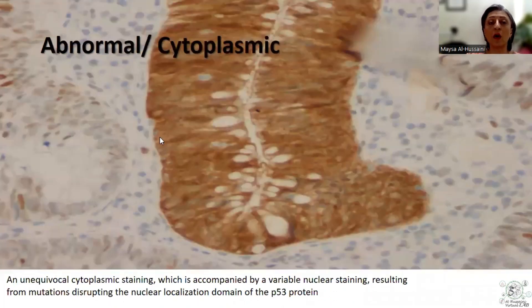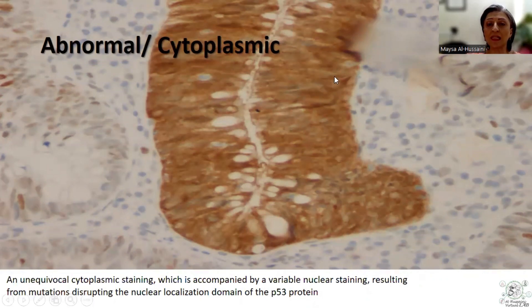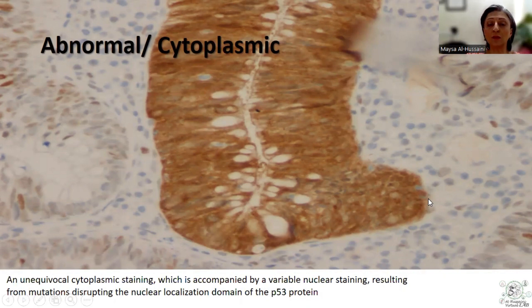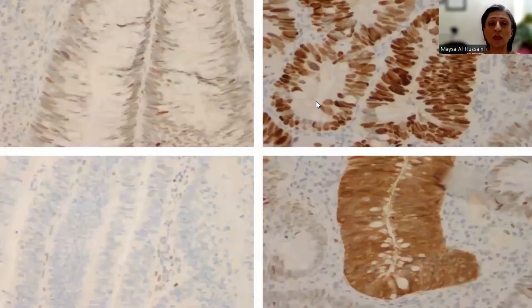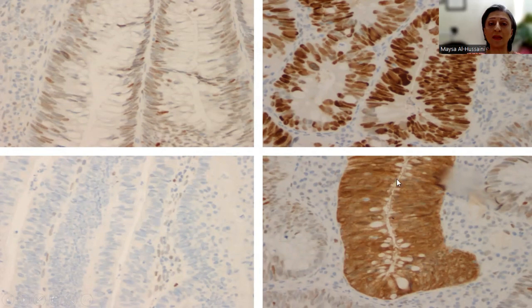The least common abnormal pattern is cytoplasmic, in which you see cytoplasmic staining associated with faint nuclear staining. This is the least common pattern, and again in the background we have some glands showing mosaic or wild-type or normal staining pattern, while this particular gland shows abnormal or apparent mutant P53 associated with cytoplasmic staining. To sum up, this is the normal wild-type staining pattern, and the three patterns — overexpression, null, or cytoplasmic — are associated with abnormal expression of P53, which is most often associated with a mutation.